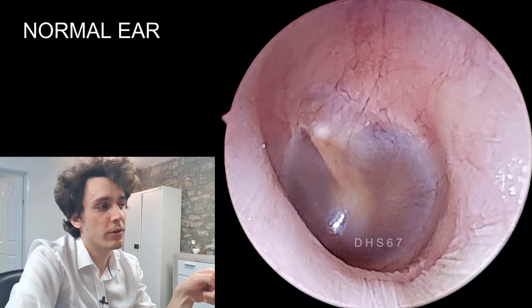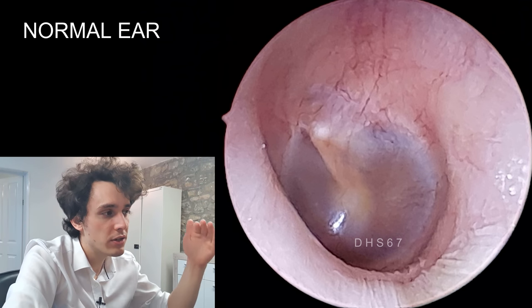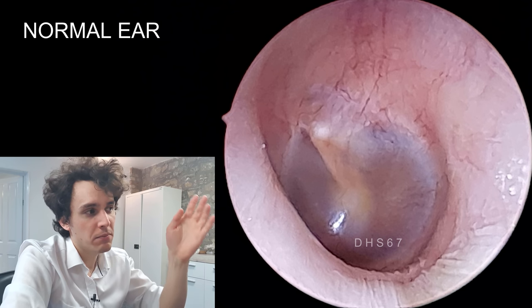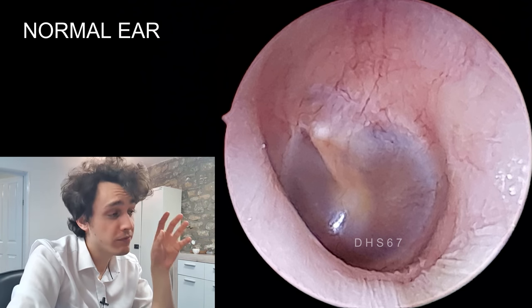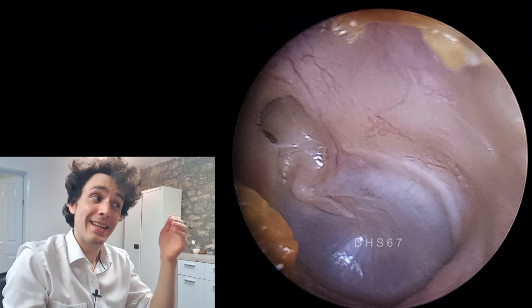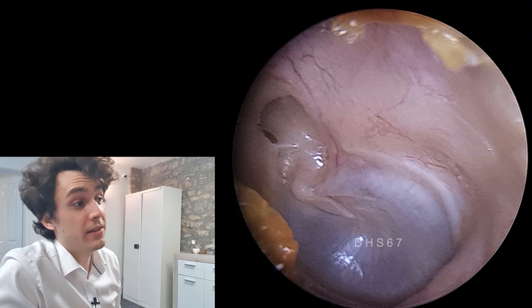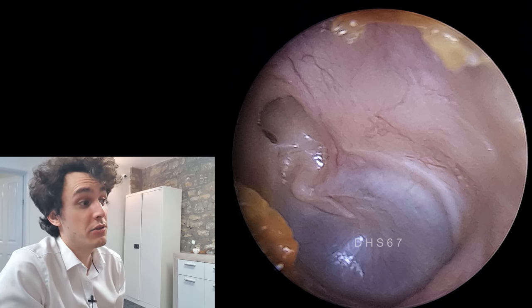This is a normal looking eardrum just for perspective, so you can see the difference — a nice pale gray ring, and above the eardrum it looks a little gray, a little pink, with a smooth surface. That's totally normal. There's the retraction pocket, and unfortunately if this doesn't resolve, this will almost certainly turn into a cholesteatoma.